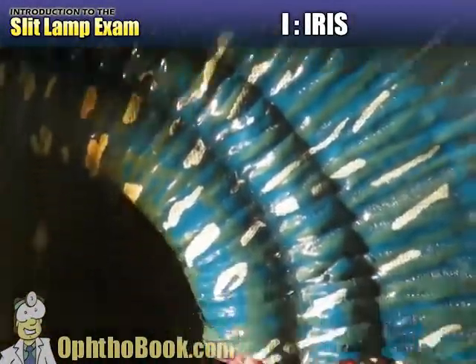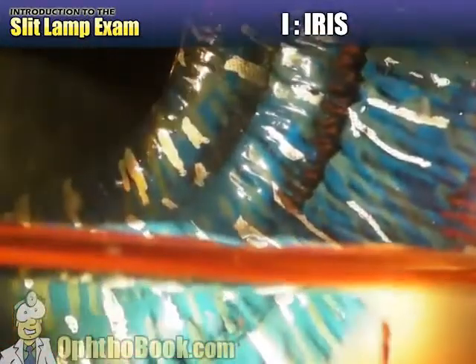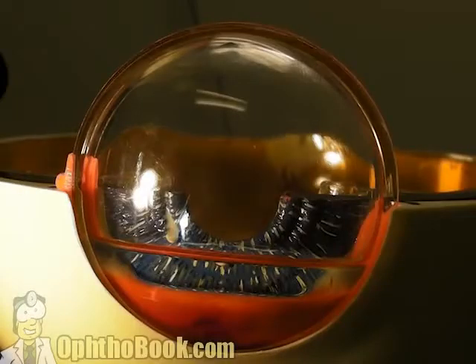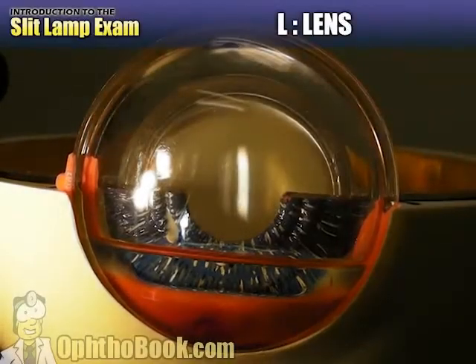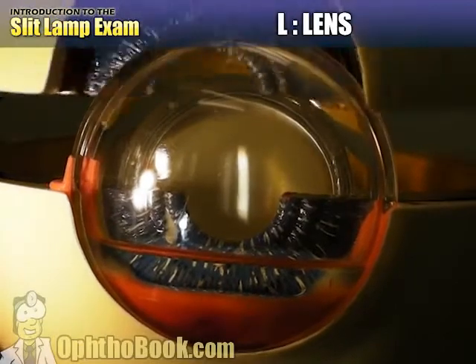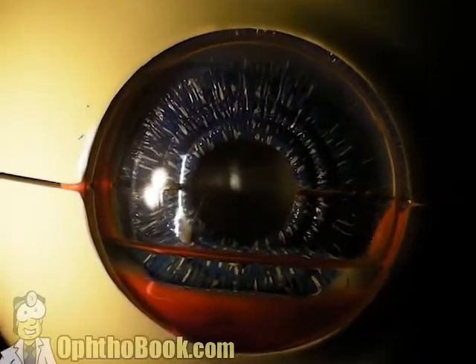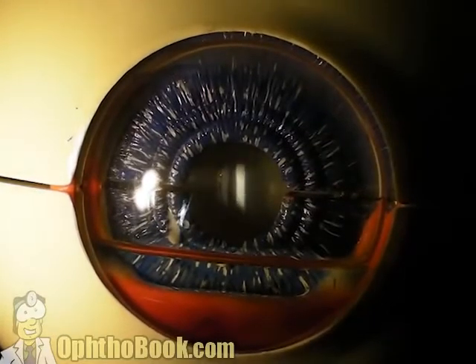Moving on to the iris, by far the easiest part of the eye to look at because it's flat and therefore always in focus, and there's usually not that much pathology on it, quite frankly. Behind the iris is the lens, and because it sits behind there, you can only see it by looking through the pupil. And the lens is another clear structure, just like the cornea is, and because of that, we can use our cross-sectional beam to look at it in the exact same way.